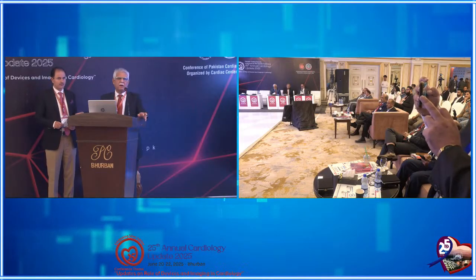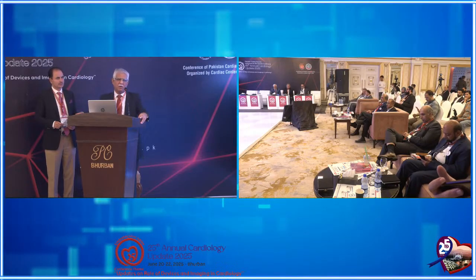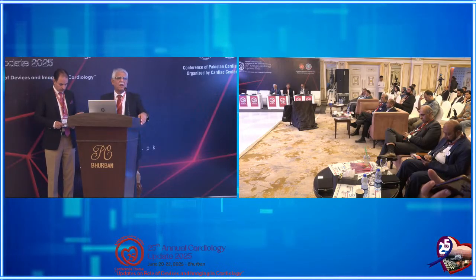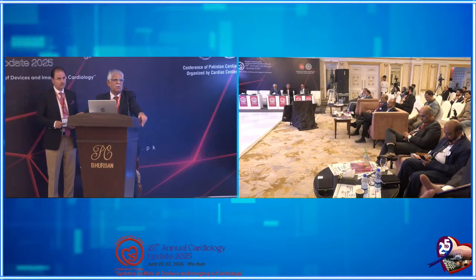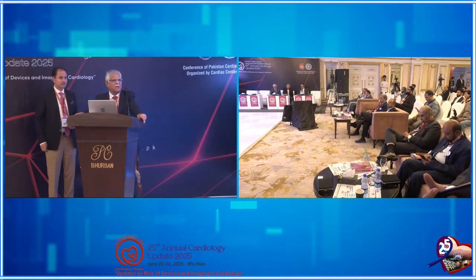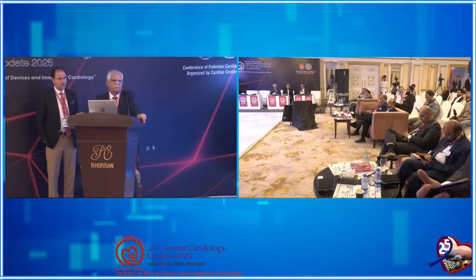But if you are compelled to do it, there are certain tricks, like reducing the heart rate to a very low level so that there's very little coronary motion, and also trying to dilate the coronary arteries a little bit so that the impact of coronary calcium on the lumen is less. In that way it may be useful. But practically most people don't stop at any calcium less than 1000.